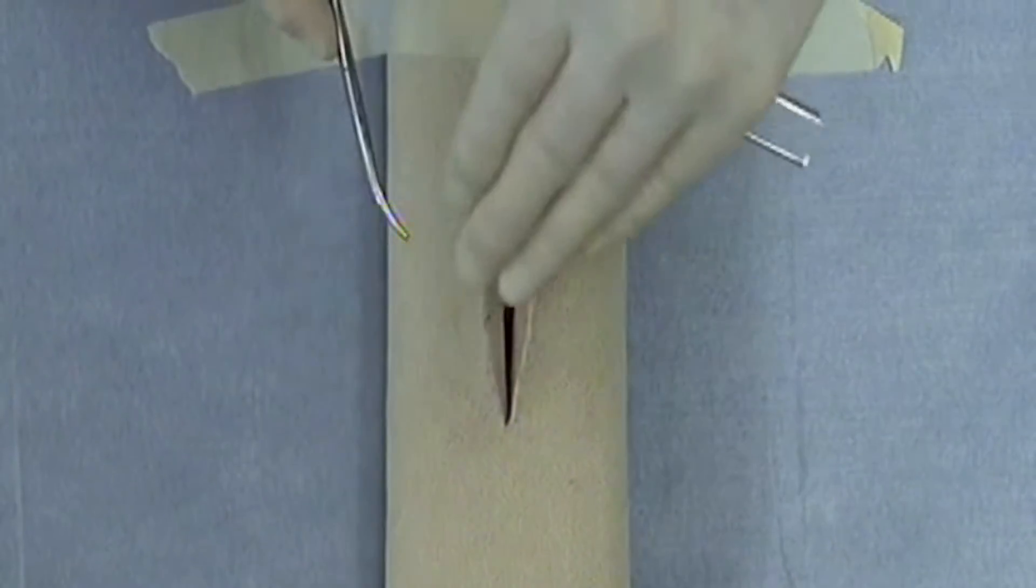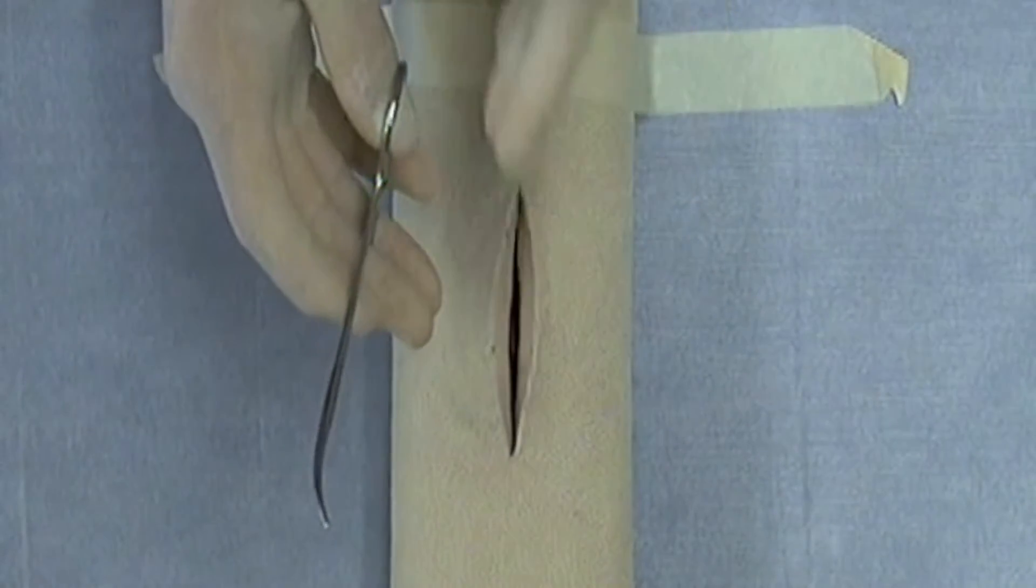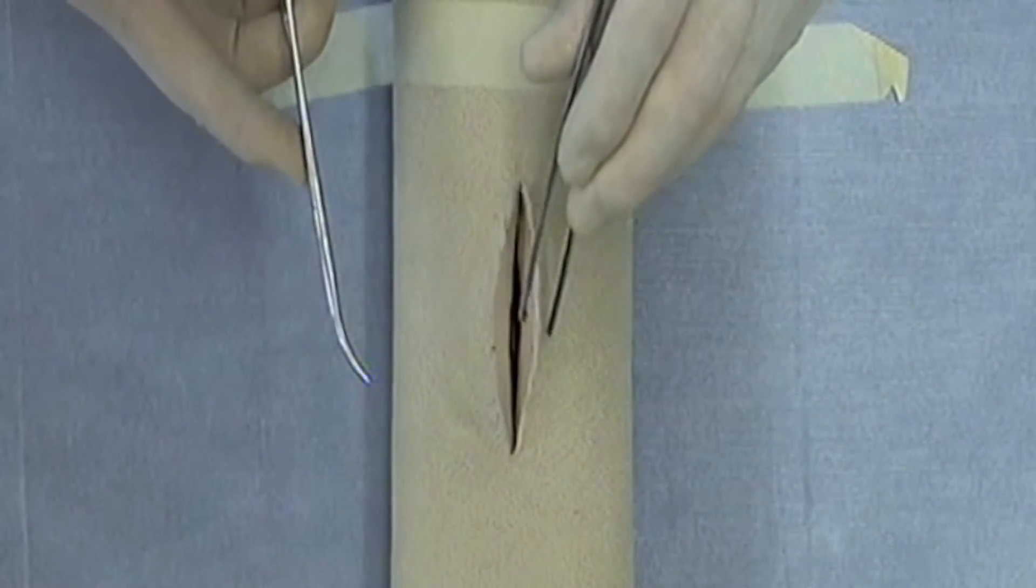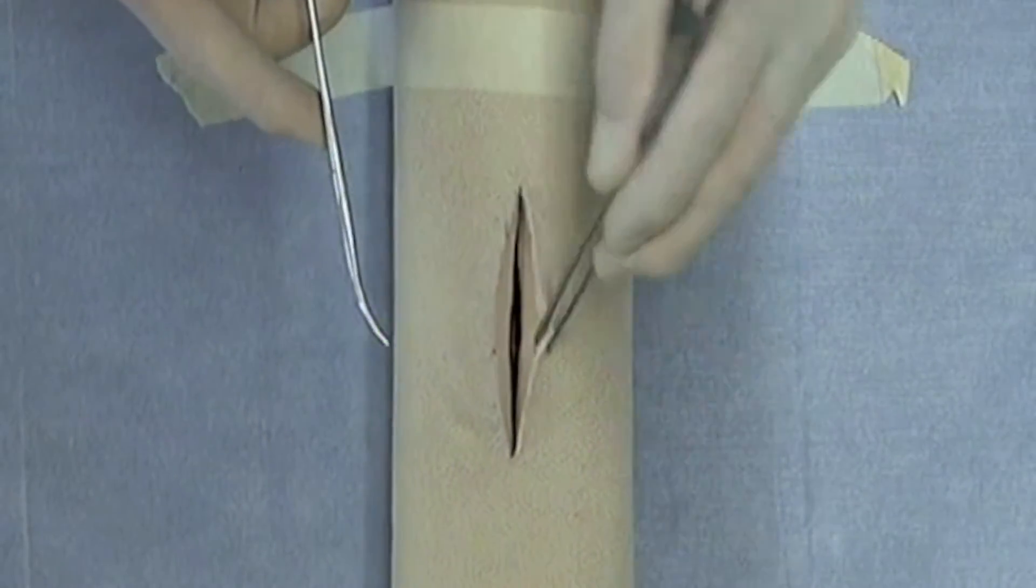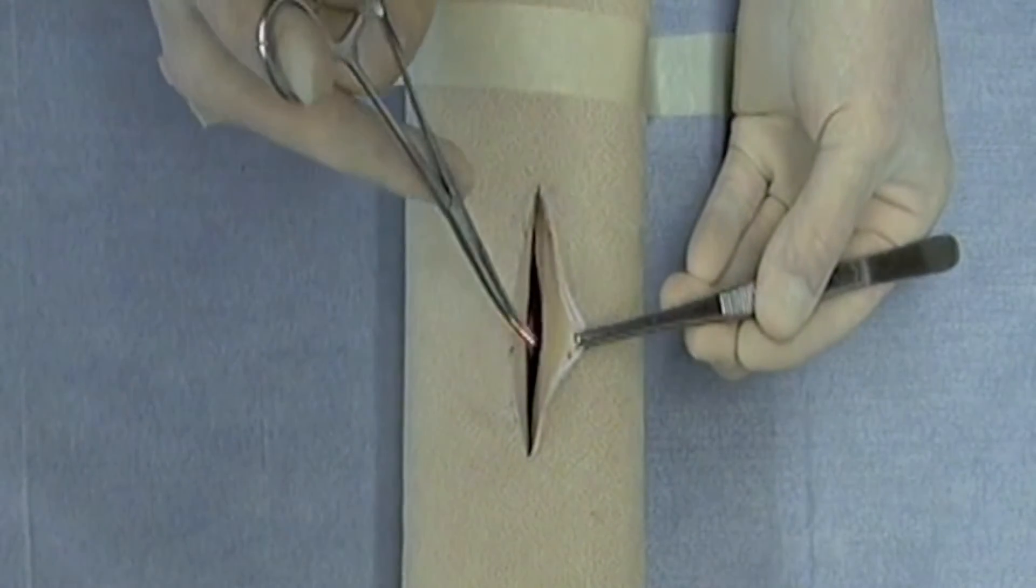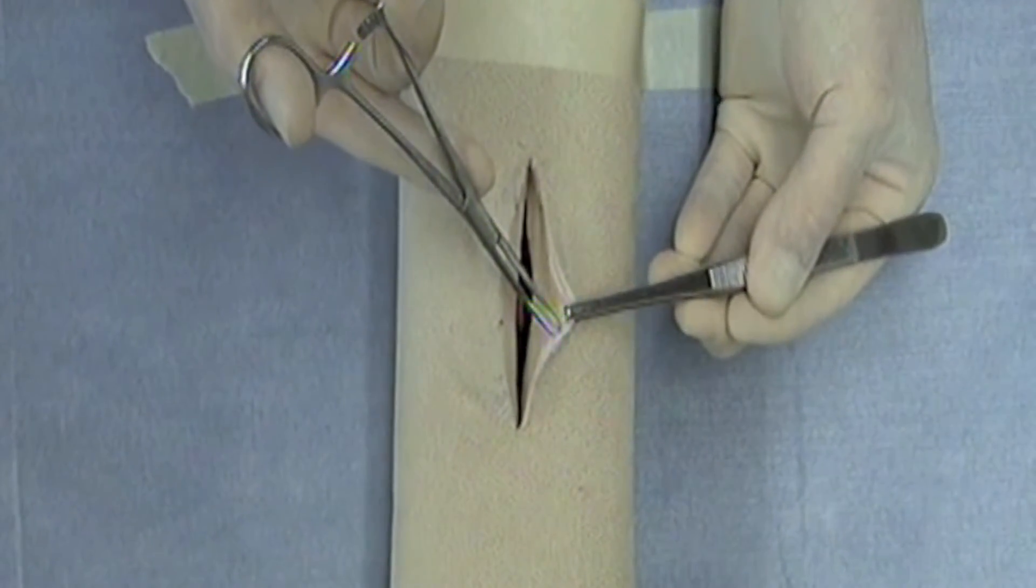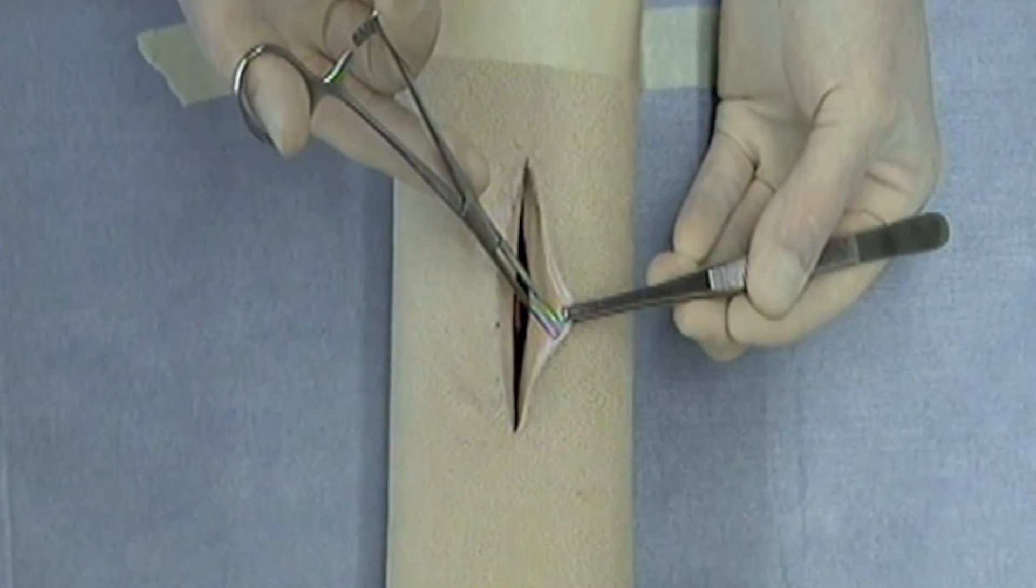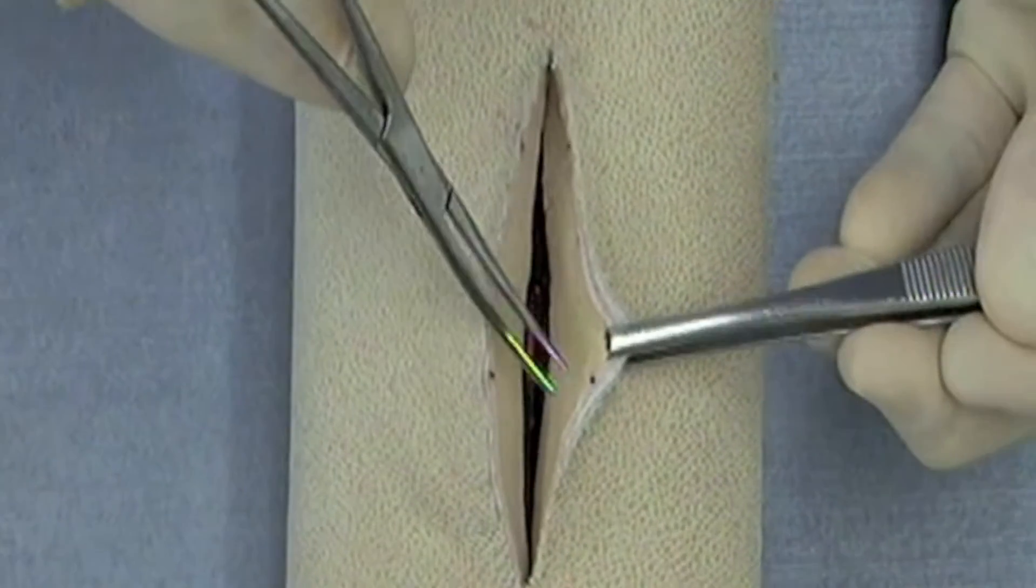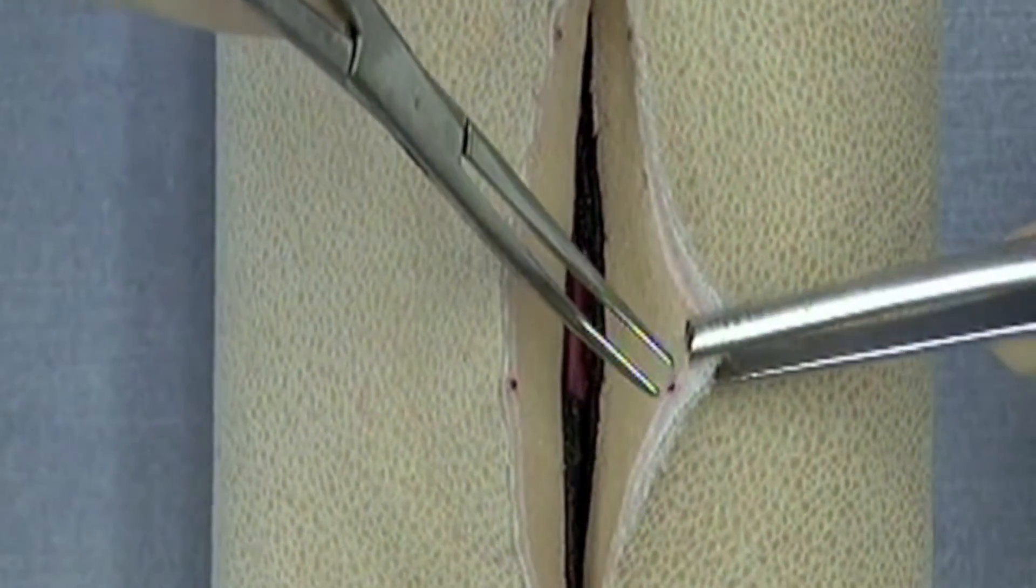The instrument is used with the curve toward my midline, which is right here. In order to properly clamp a vessel, you're going to use your rat tooth forceps, roll the skin edge out, and you're going to actually place the two limbs of the hemostatic forceps down. You press into the tissue and you grab the vessel, which is sometimes easier said than done.